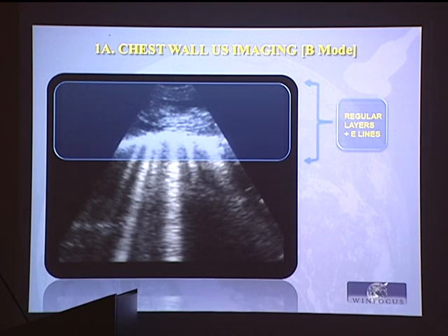What is the physiopathological diagnosis? Suggesting subcutaneous emphysema. What is the clinical diagnosis? Then it depends on the original question. Maybe confirming a tracheal lesion, confirming a pneumothorax, confirming a gas gangrene development of a certain infection site, confirming a damage of the lung, of the bronchus, et cetera.